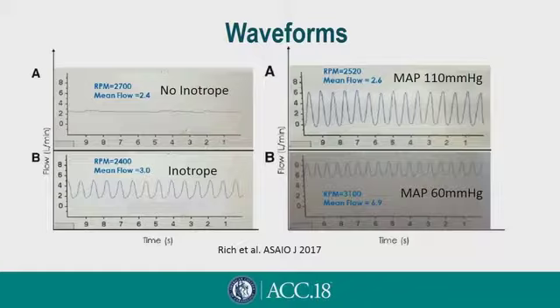You can see improvement in contractility and flow variation during the cardiac cycle. In the second panel on the right, you can see the impact of hypertension on pump flow. Hypertension reduces pump flow, causes more native output with more pulse and more variability in flow. When you reduce the afterload, you can see that the actual flow goes up and the degree of pulsatility goes down.